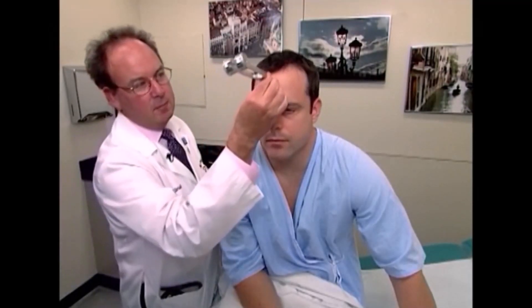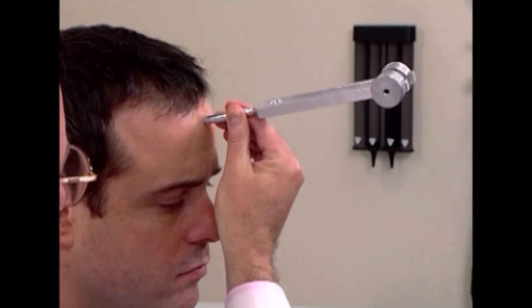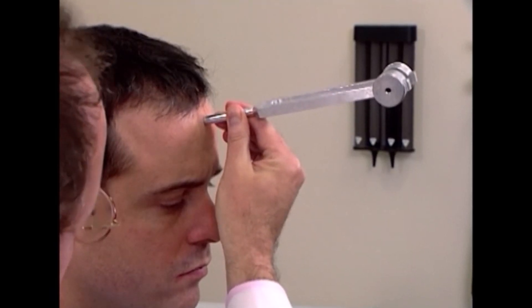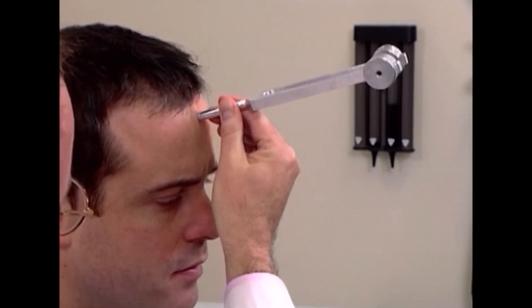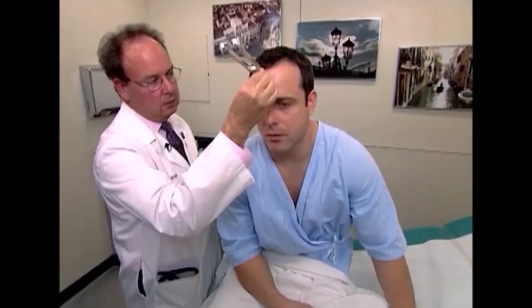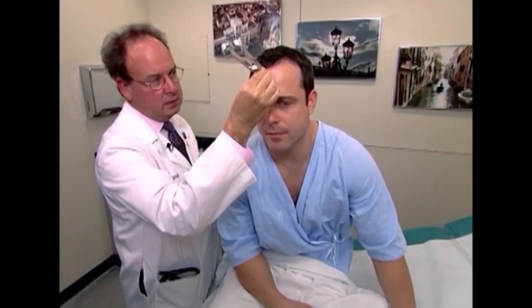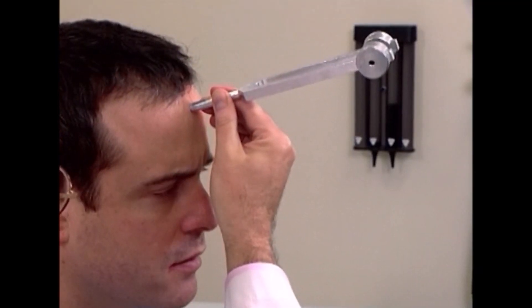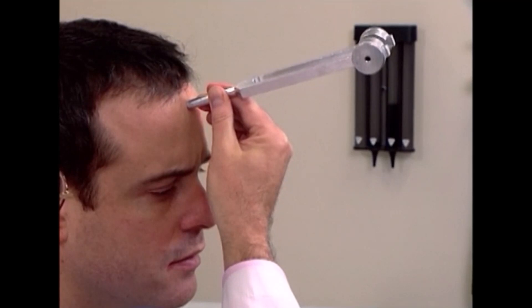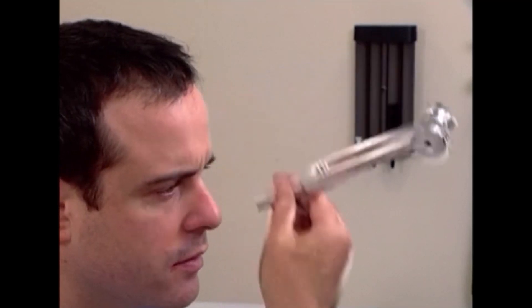The second test is the Weber test. One strikes the tuning fork and places it midline on the patient's forehead, and the patient is asked: do you hear or feel anything? Tell me what you hear or feel. Vibration. Where do you feel it? Both sides of my head. Does it feel equal, or is it in one place louder than another? It feels equal. We call that no-lateralization, and that is the normal Weber test.